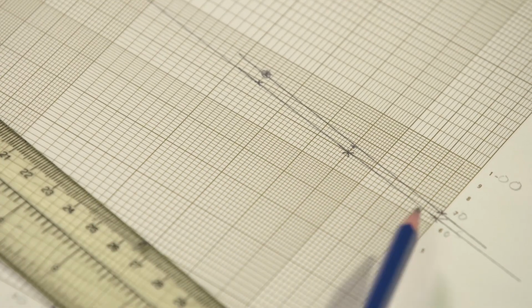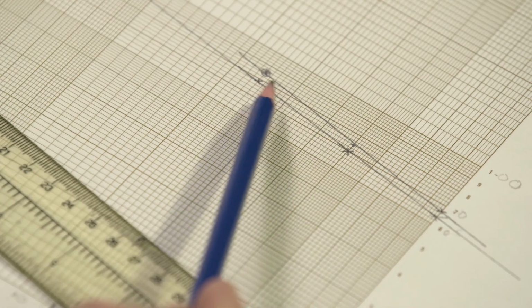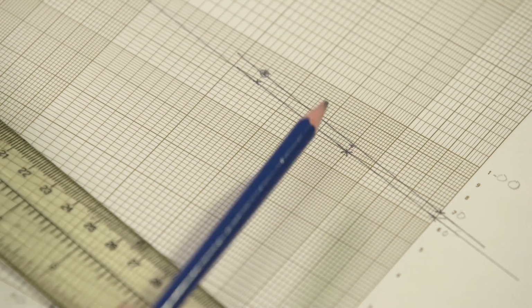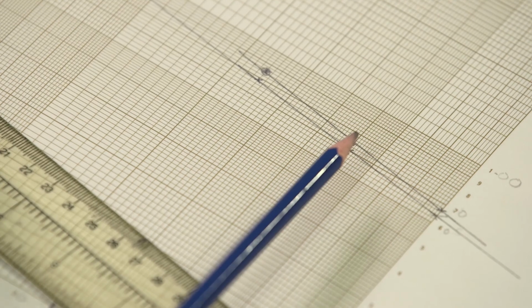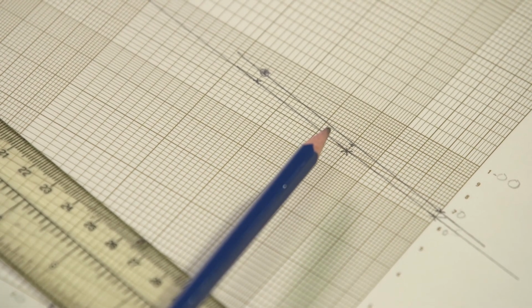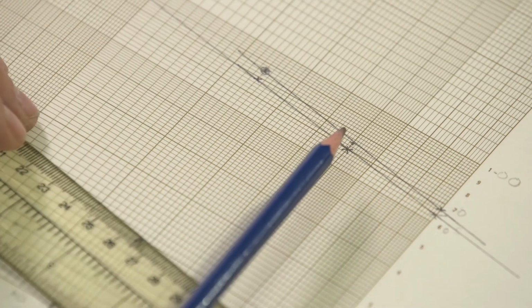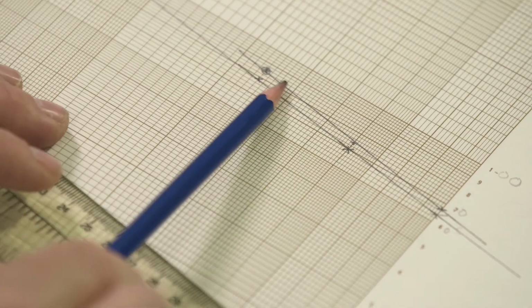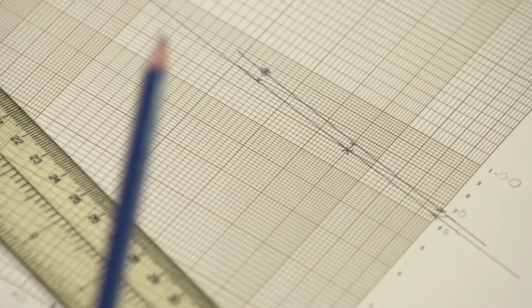Is it a straight line? Yes. Is it parallel to the standard? Yes. Is every point exactly on the line of best fit? I don't think so, but very close. And again, this is a feature of the assay that even a very small difference, 1 or 2 seconds, can start to move this line substantially in terms of the location on the graph paper. So we need to take some care in the plotting. So this is the IQC sample. Straight line, parallel to the standard.